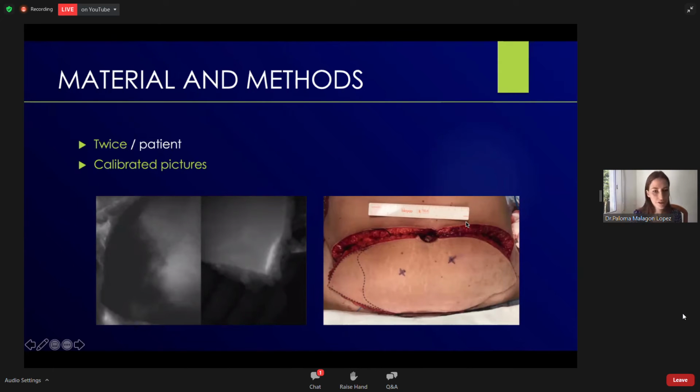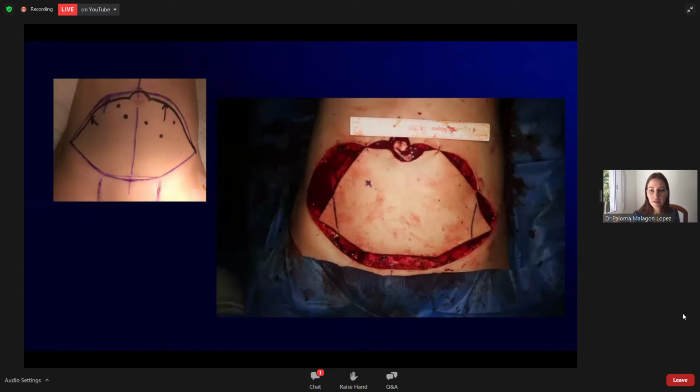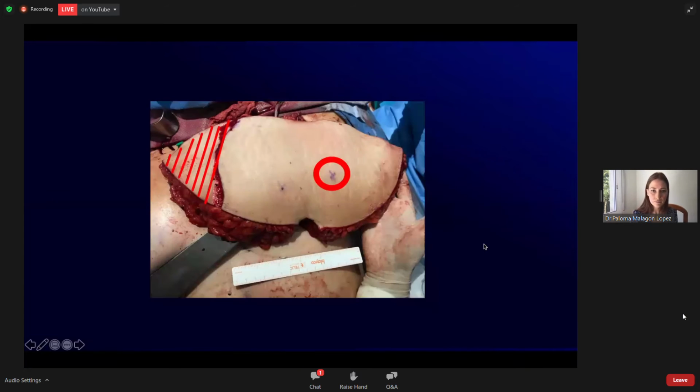With these pictures, after the surgery, we analyzed the size of the non-perfused area and the total area of the flap using a very interesting software called ImageJ, which allows us to measure irregular areas. And we can compare the first measure, in the donor area, and the second measure, after the anastomosis in the breast, in each patient. Here is another case. We have here the perforator location and the non-perfused areas. Another case, our perforator and the non-perfused area of the free flap.